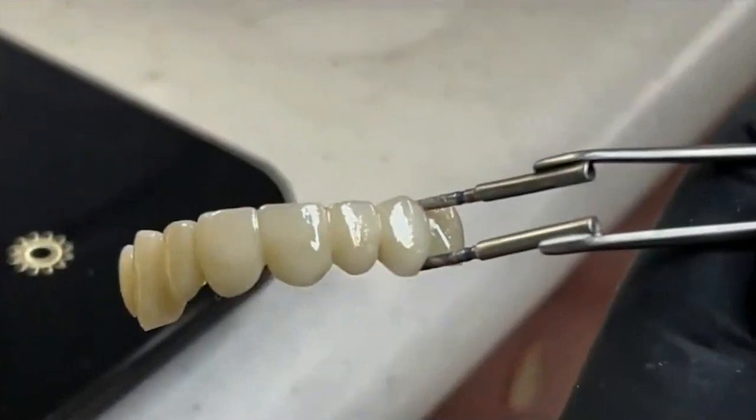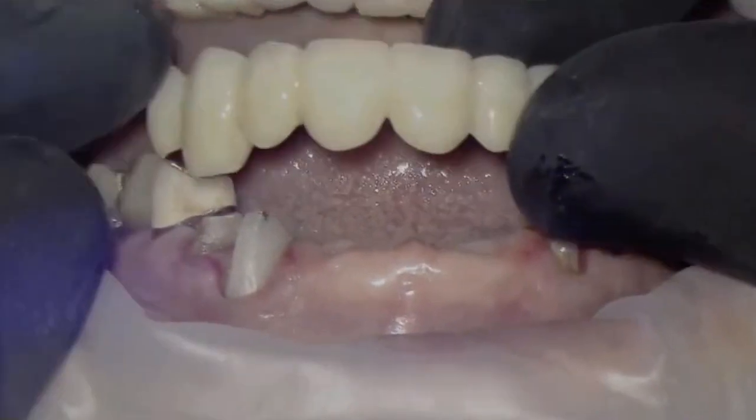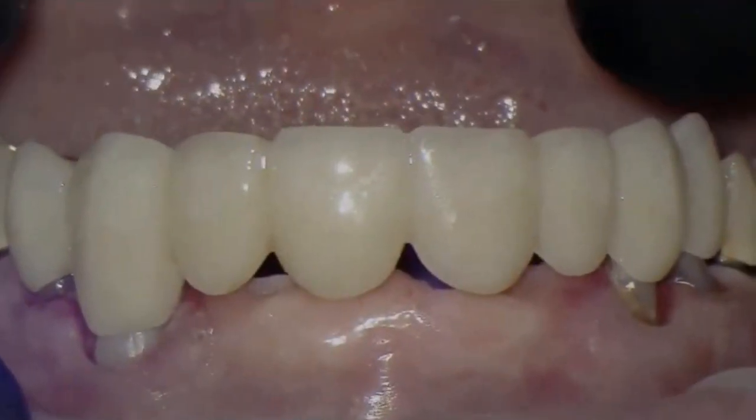Once we do that, see, it looks more natural. And see this, pay attention to this. See how beautiful these restorations are going to sit. Look at that, push in.